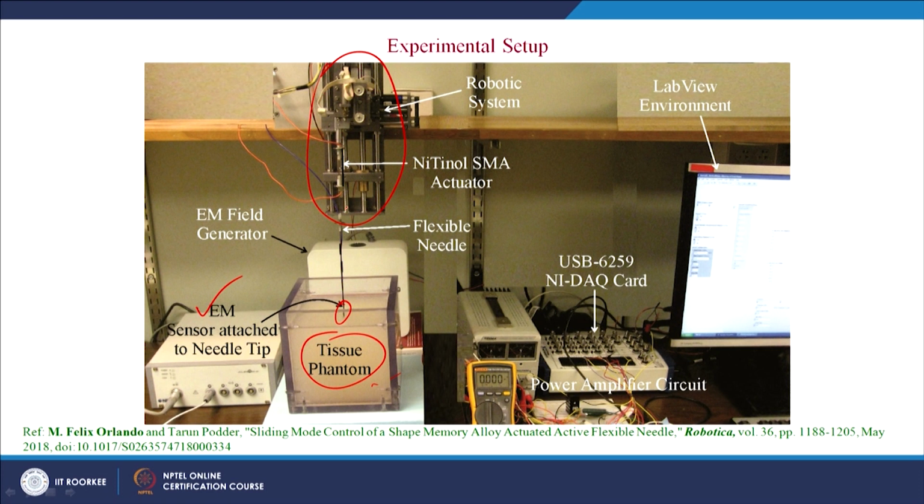Here the needle base is attached, and here is the actuator, which is the nitinol SMA actuator. We have the interface by USB 6259 NI DAQ interface, and the power amplifier circuit is to amplify the input current to the range of 0 to 0.75 ampere, and the working platform is the LabVIEW real time platform.